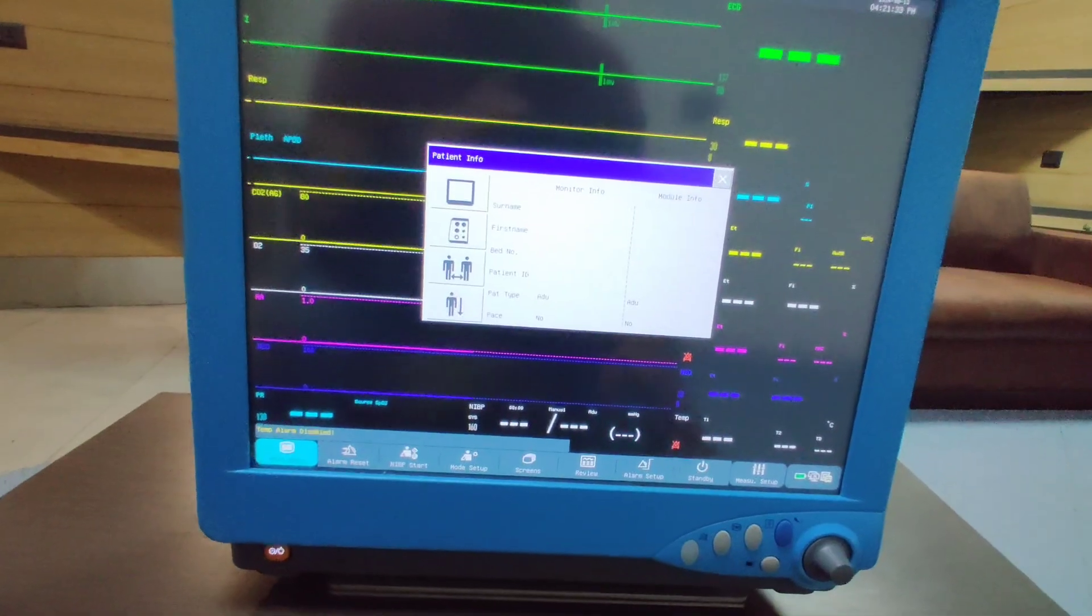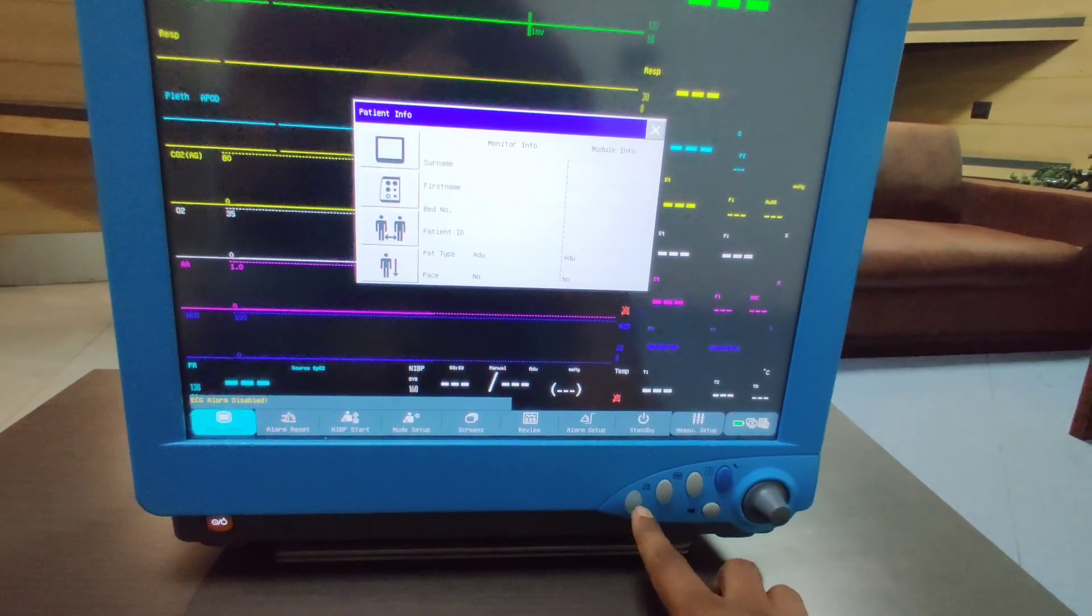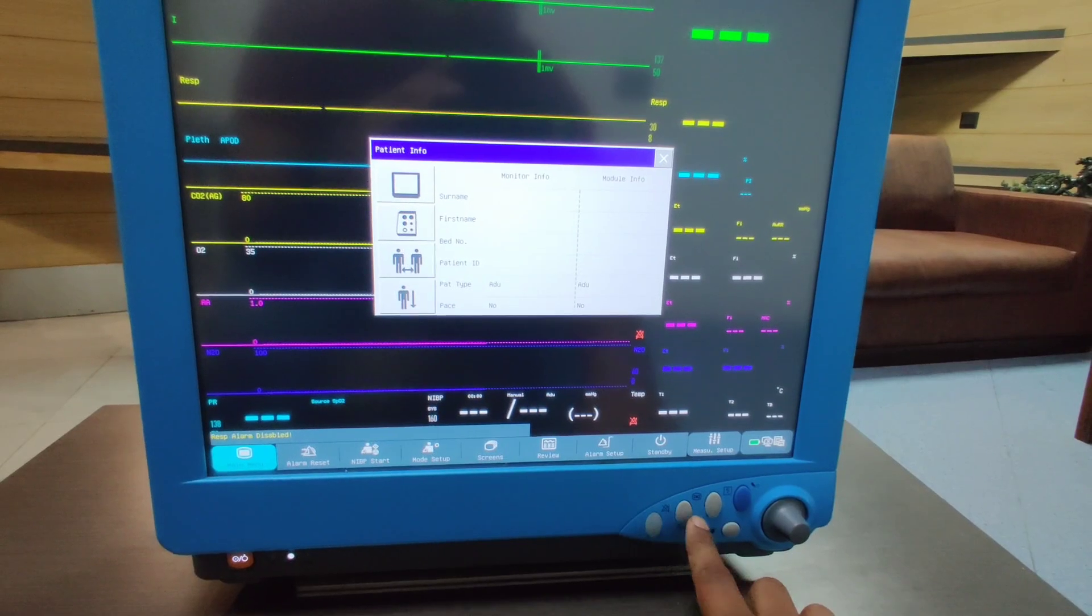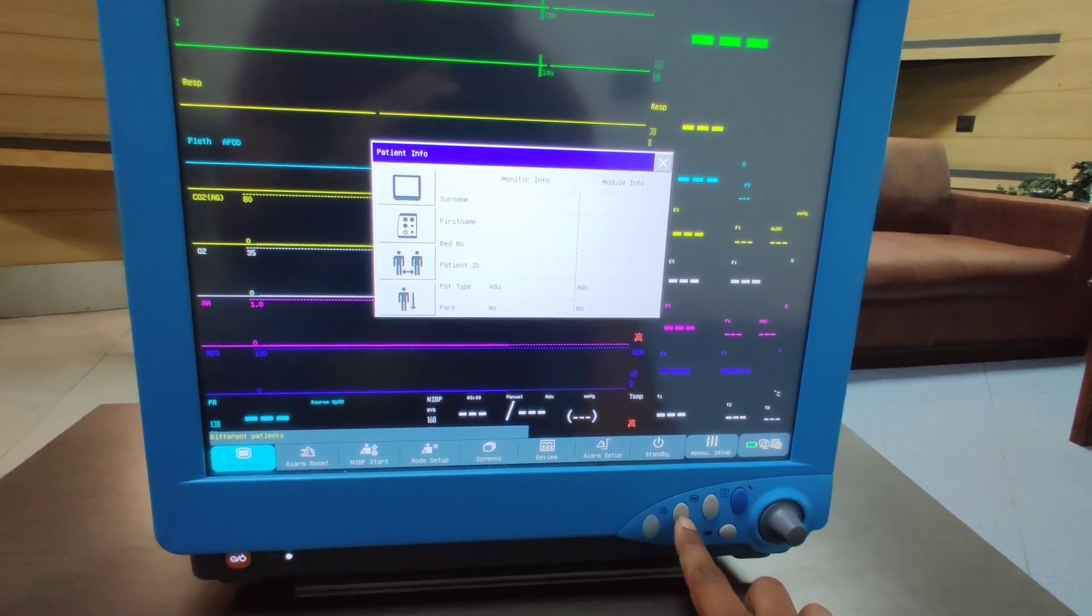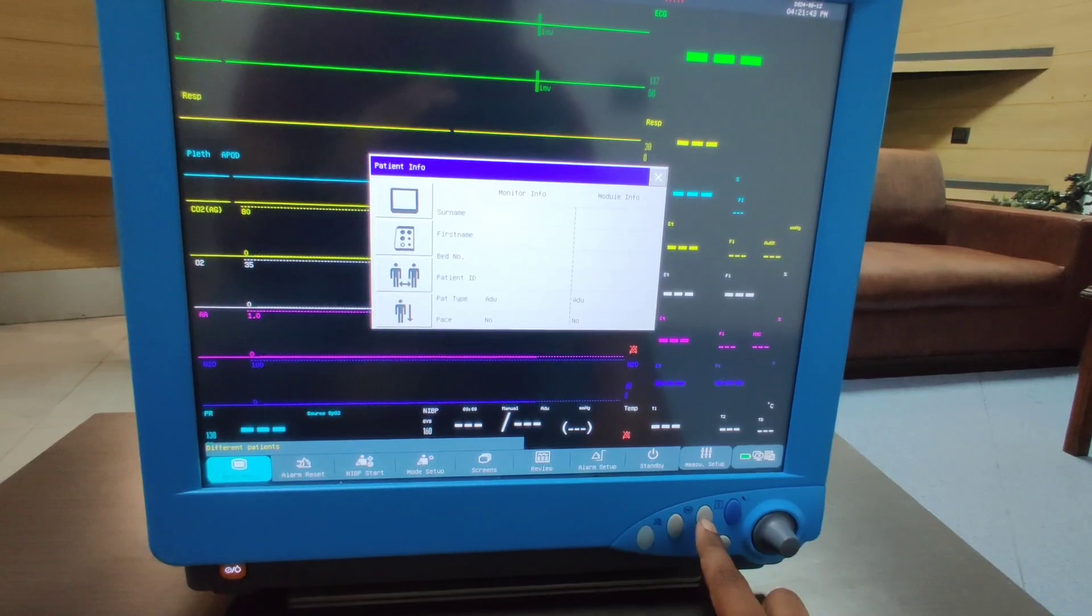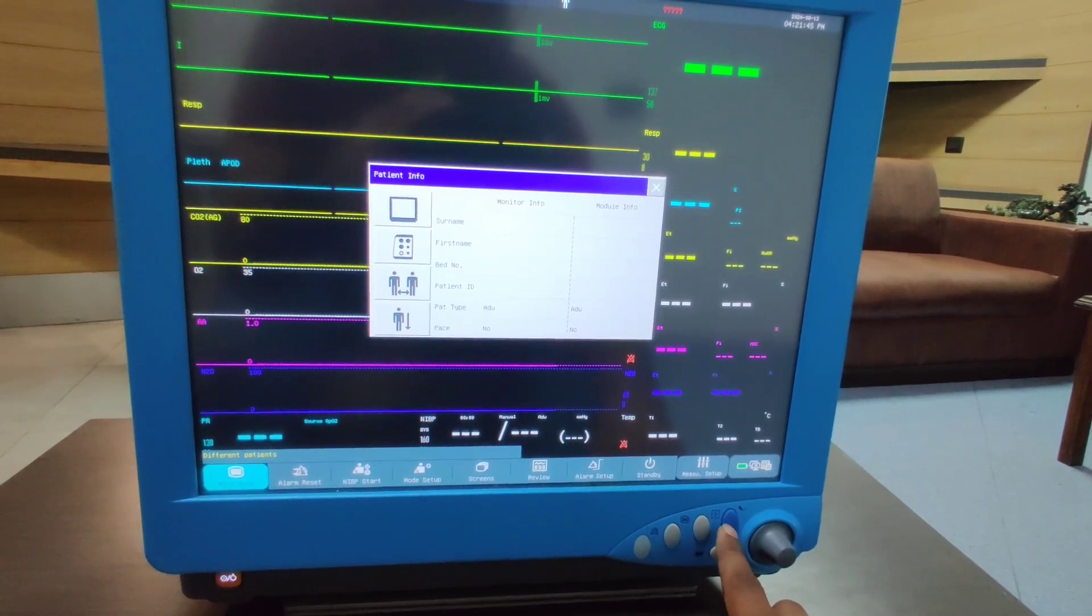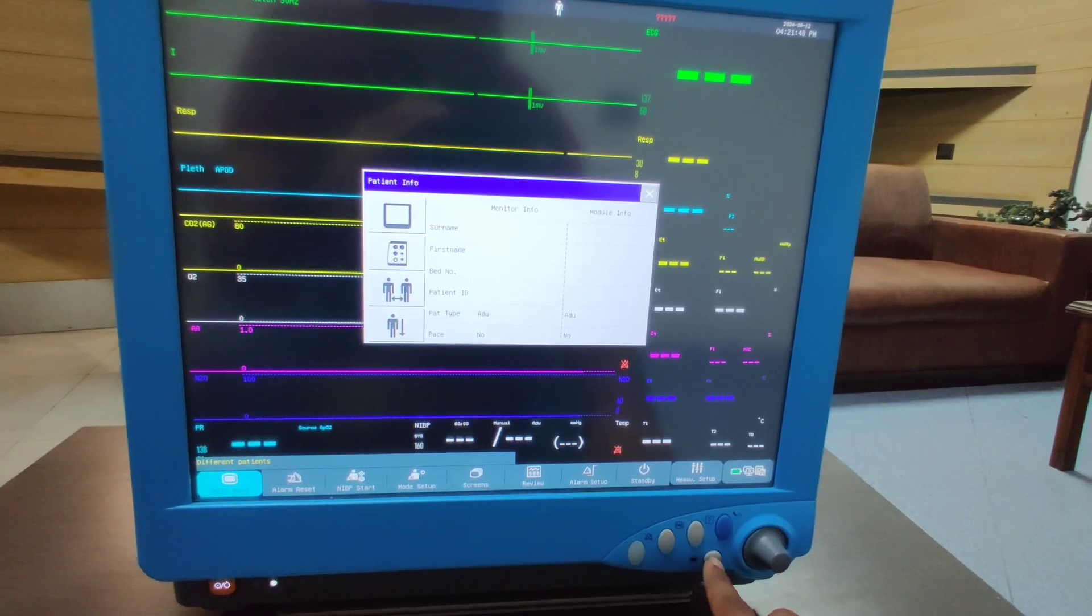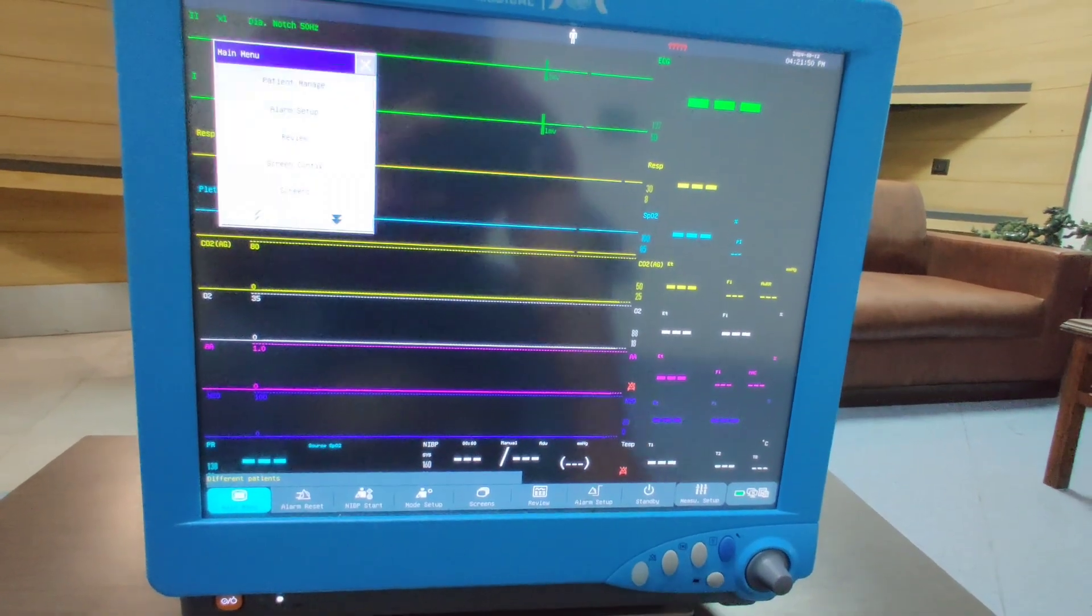On the lower side we have all the shortcut buttons. This is for silencing the alarms, this for freezing the waveforms, this for taking out the printout from the thermal recorder, this for activating and deactivating the non-invasive blood pressure, and this for going into the main menu.